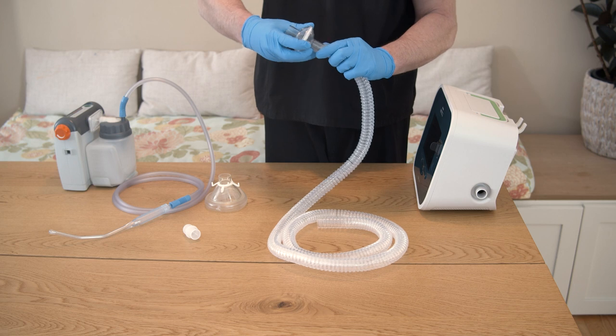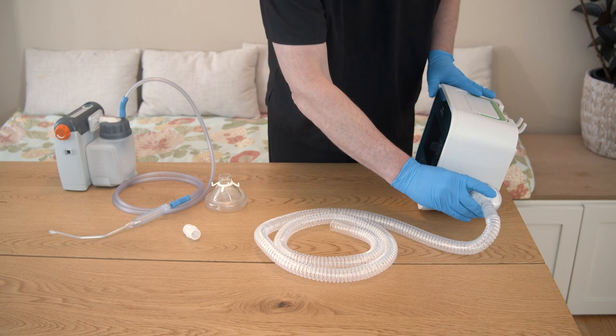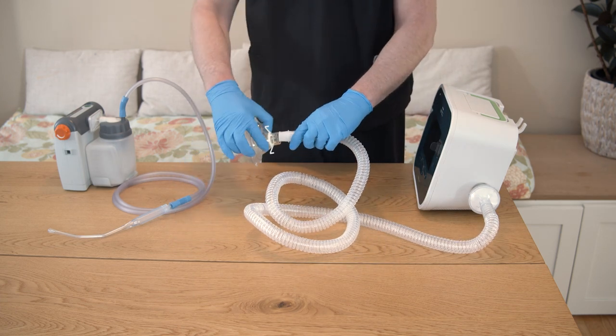Connect the filter to the tubing, then attach it to the cough assist device. Put the adapter, then the mask, on the other end of the tubing.